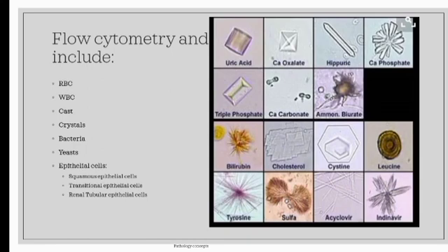Next is bilirubin crystals. They are abnormal crystals in the urine. They are associated with liver disease or disease of biliary system. They appear as yellow-brown or red-brown needles, granules, or plates and often irregular shapes.